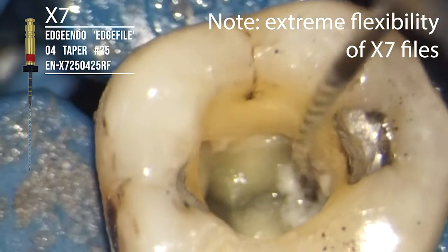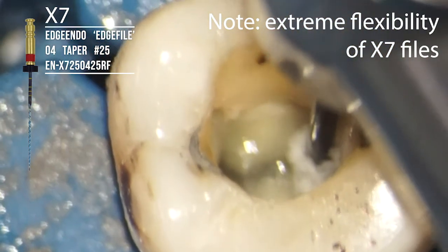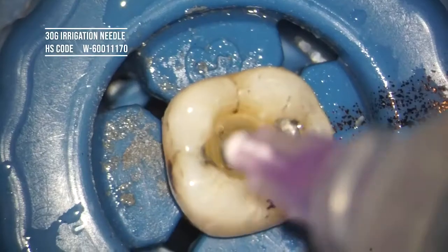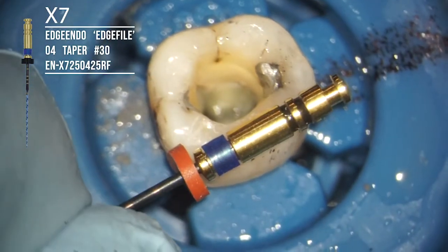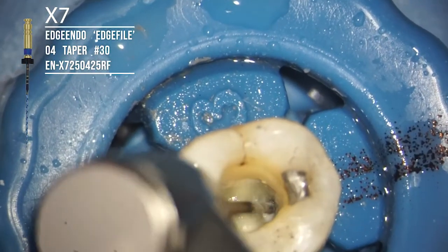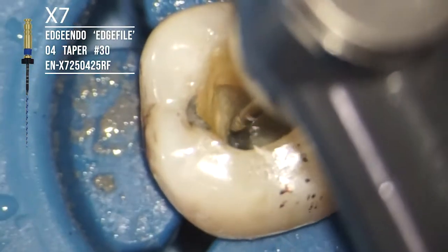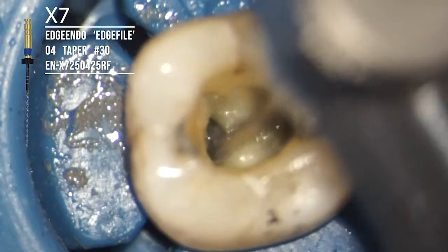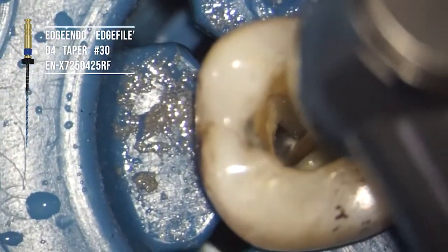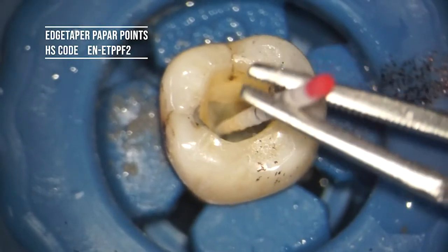Amazing, especially on uppers when you're working into the buccal root system, how easy it is to pre-bend those files and just slide them straight into the buccal roots. And irrigate, irrigate, irrigate. Sodium hypochlorite 3%. Size 30 in the distal root, and size 30 in the mesial, mesiobuccal and mesiolingual. And these just slide right around that curvature in both the buccal and the lingual. Yeah, and obviously this is sped up just to save time by about 4 times. So it's looking like I rushed it, and that's because I did. And then irrigate, irrigate, paper point, and finish.